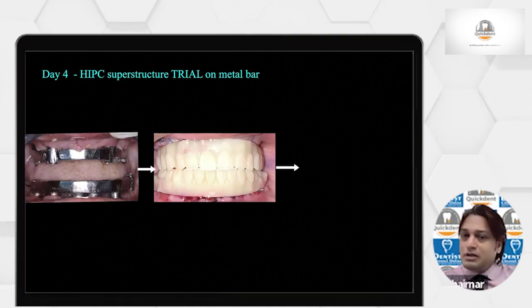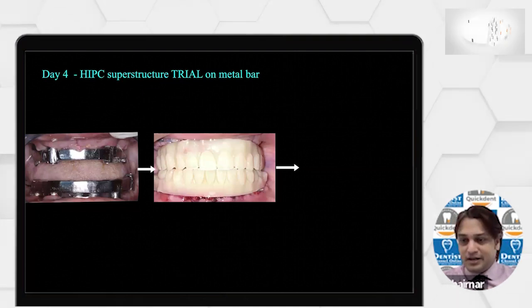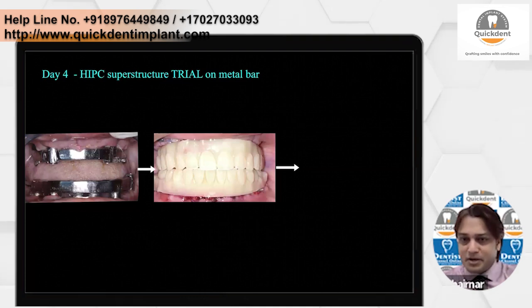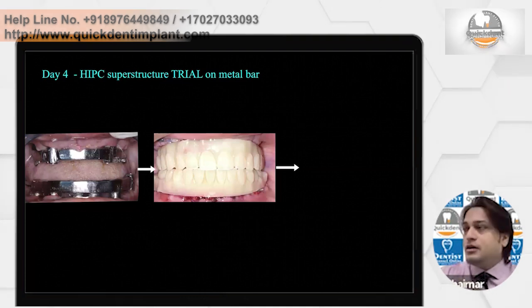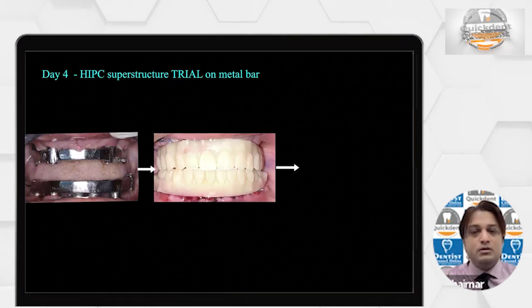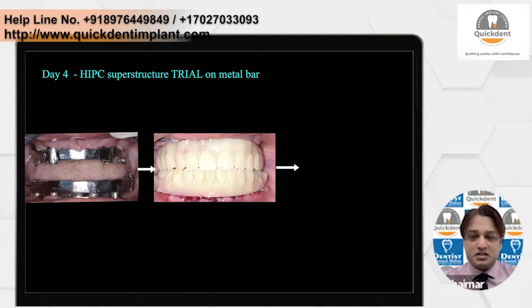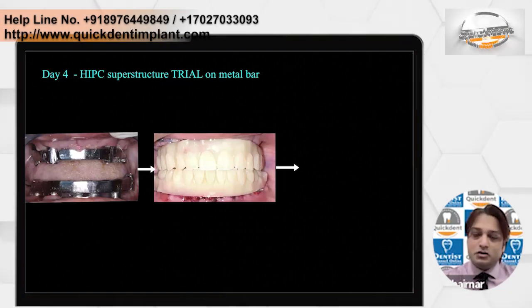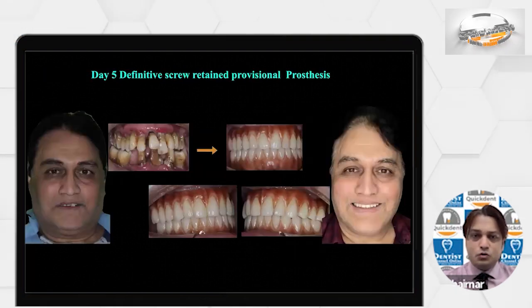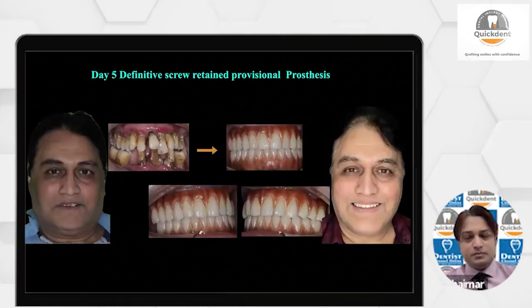Now this is different from metal porcelain. With metal porcelain, the procedure was different. I'm showing you something called hybrid. Why didn't I prefer to go for metal porcelain? Because the teeth will be very heavy, it will be loading the implants too much. So we went with a lighter version of teeth, and that's how we got the final result of the patient. Okay, so everything is screw retained. This is the before and after of the patient.